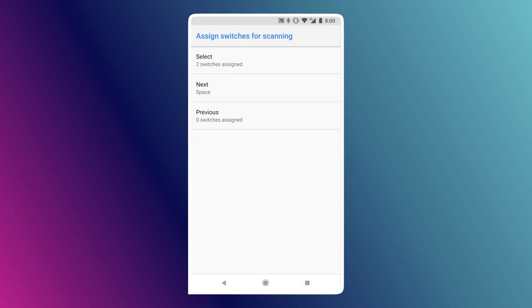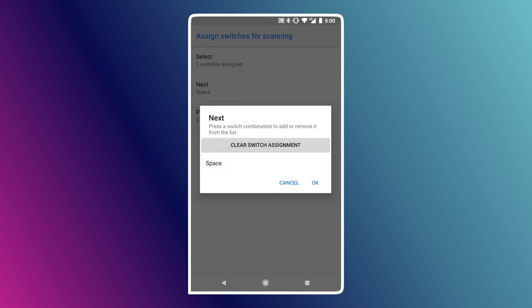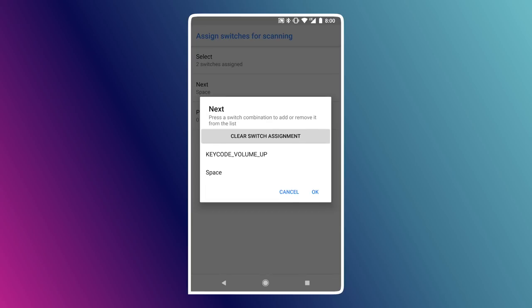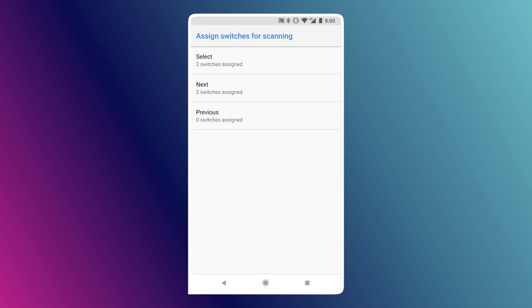Then you've got Next and Previous actions. Since I only have one or two volume keys, I'm going to use only the Next action and assign that to this other volume key. We can skip using the Previous action for now — we'll just use Next to jump around the page and then use Select to click on things.